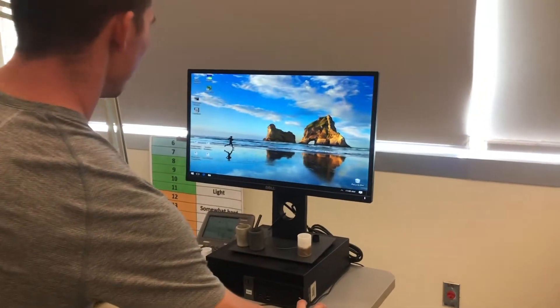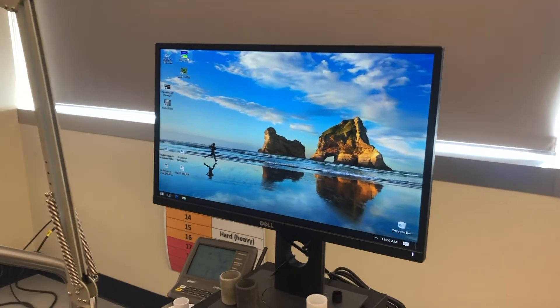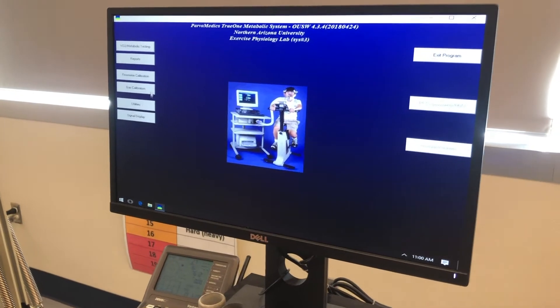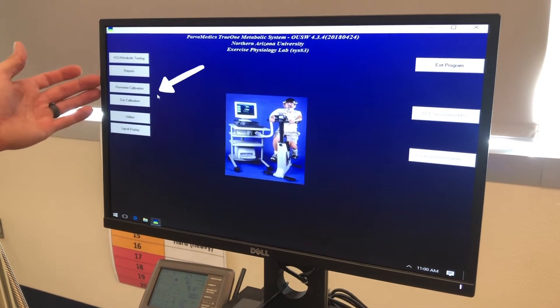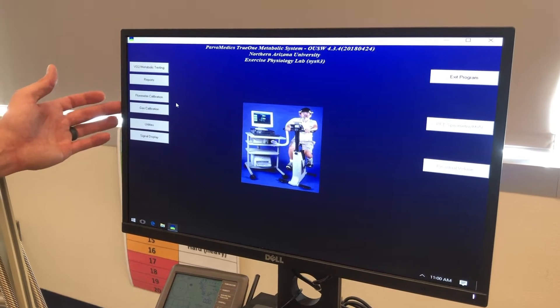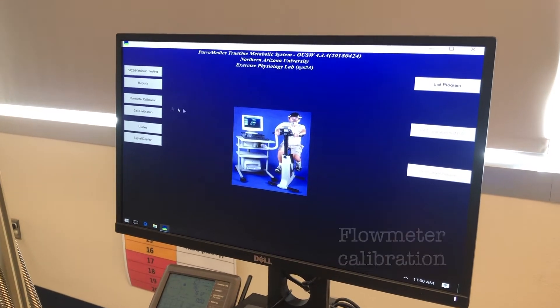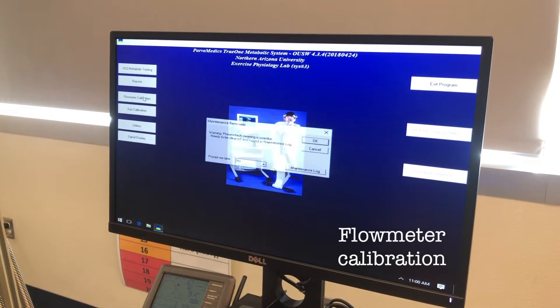I'm going to open up the software for the metabolic cart, which is TRU1. On the left-hand side, we have flow meter calibration and gas calibration. The flow meter calibration is the one we're going to do first, so I'm going to click on that.